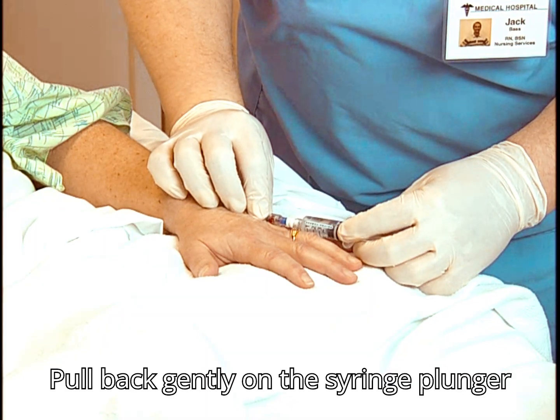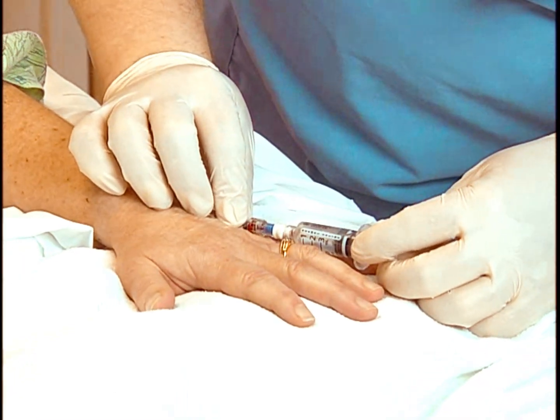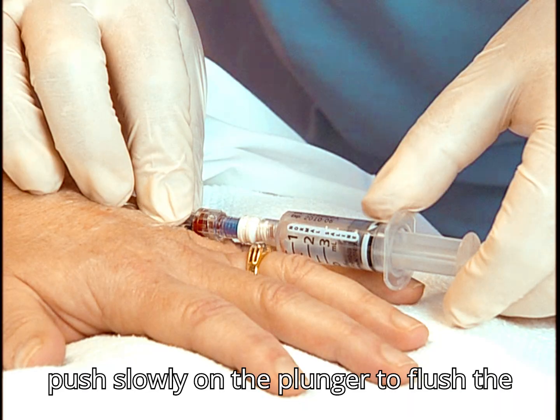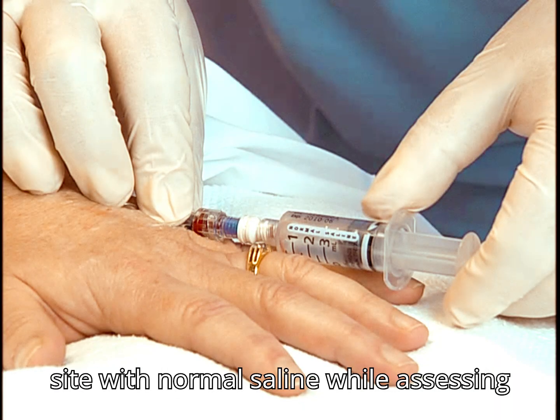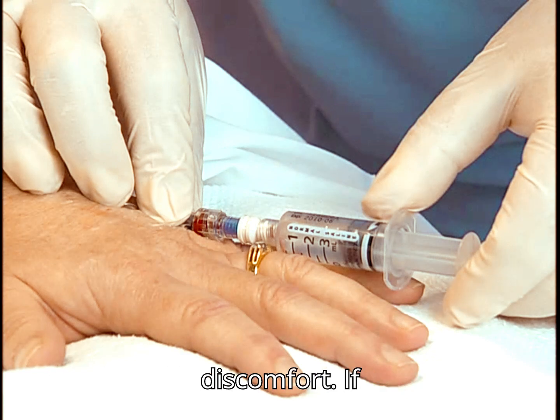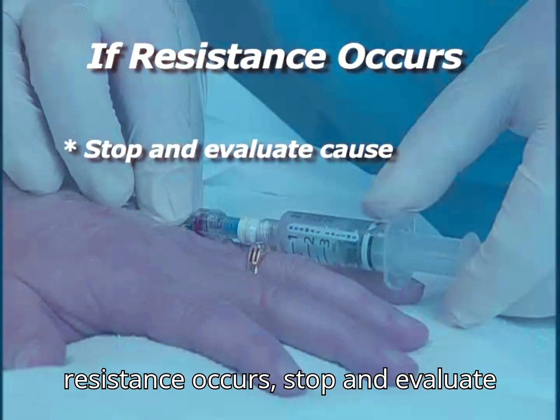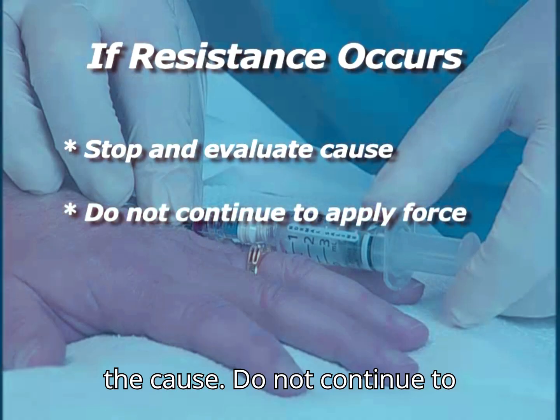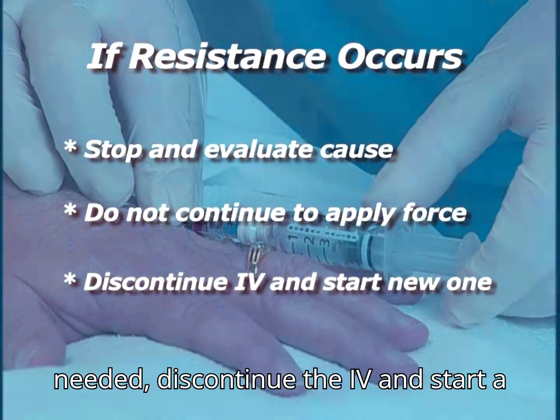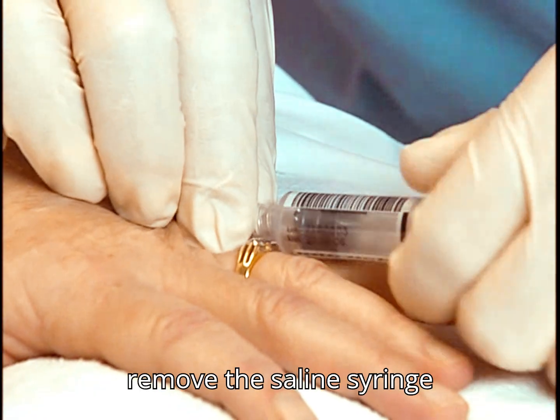Pull back gently on the syringe plunger and check for a blood return. If the IV device is in the vein, push slowly on the plunger to flush the site with normal saline while assessing for infiltration, resistance, and discomfort. If resistance occurs, stop and evaluate the cause. Do not continue to apply force. If needed, discontinue the IV and start a new one. Then remove the saline syringe.